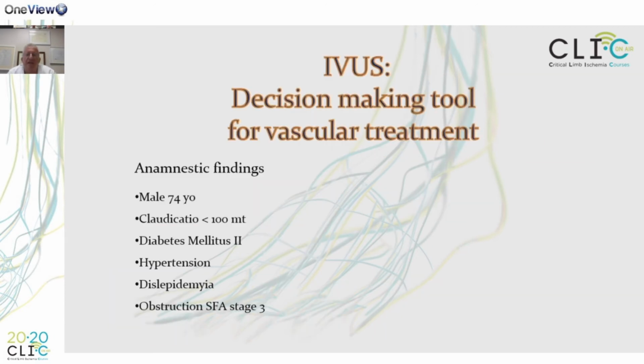The question, the challenge for the interventionalist, is what is the optimal diagnostic modality to analyze the target vessel? Which is the optimal recanalization modality? How to maintain the lumen?